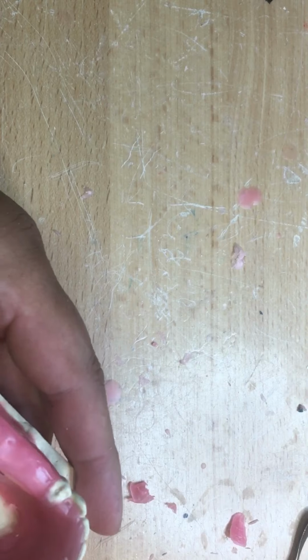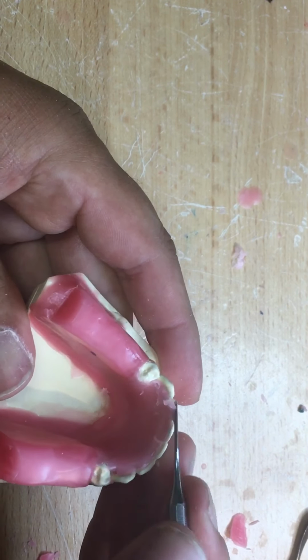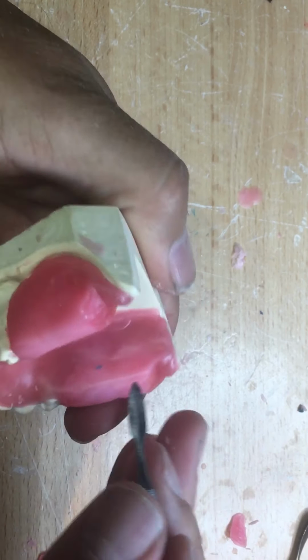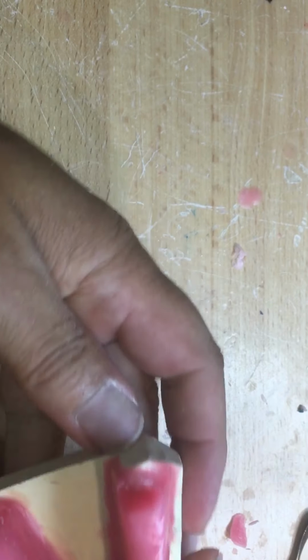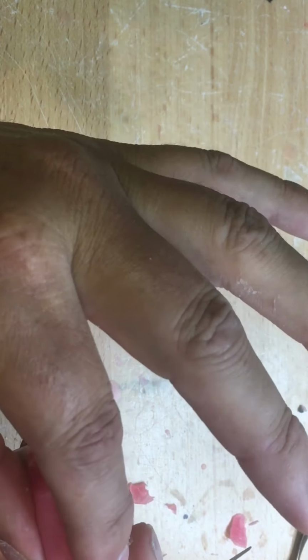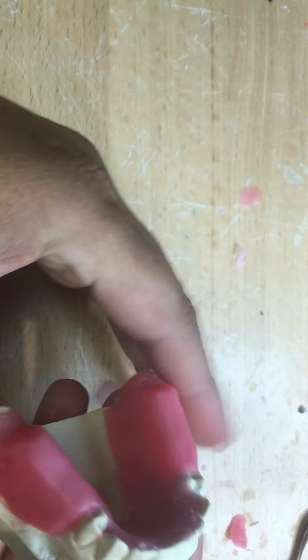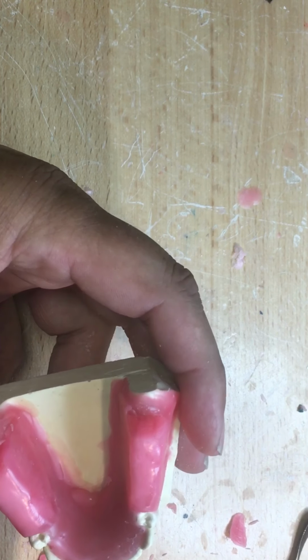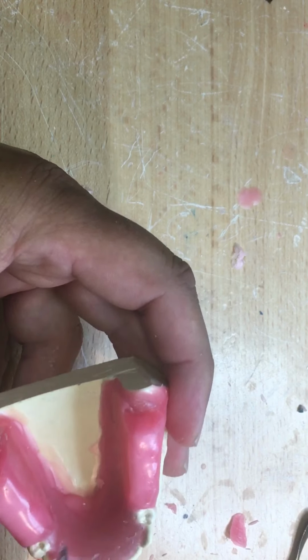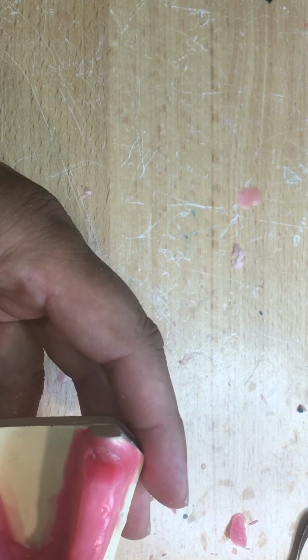Now, the better fitting the occlusion rim, the more positive seat it will have in the mouth, and therefore the better chance of taking accurate registrations. That's the bottom line. And then your job as the beginner dental technician is to do this in an expedited amount of time, so that you can do something else. Is this glamorous? Playing with wax here, a little bit of acrylic? Not really, but it is necessary.